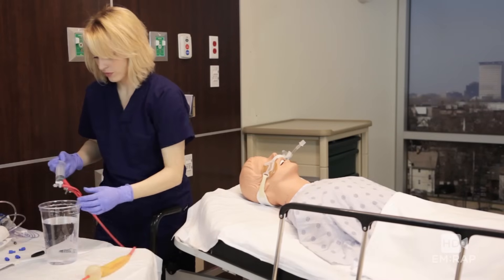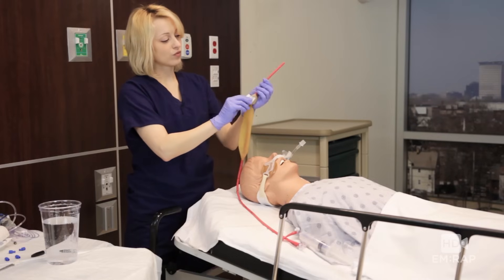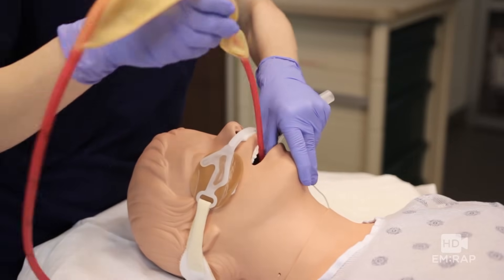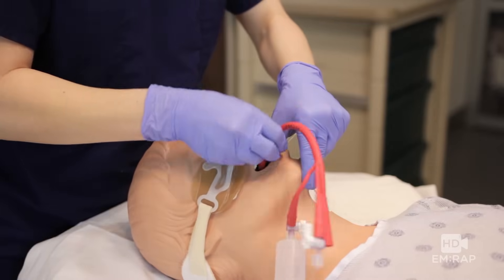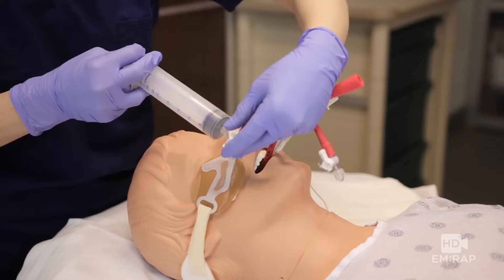Deflate that balloon all the way, and now we're going to get ready to insert this thing. Get some water-based lubrication, lubricate the tube and balloons, and insert it just like an OG tube. Technically you can go through the nose, but the mouth is easier. Insert it all the way, and now we want to confirm it is in the stomach, not the esophagus.